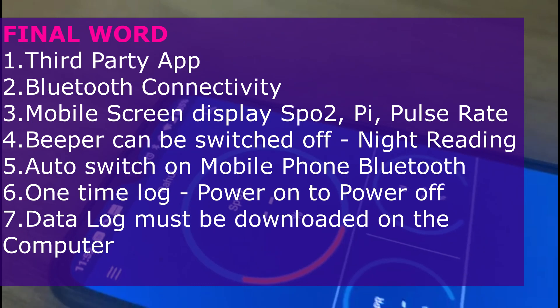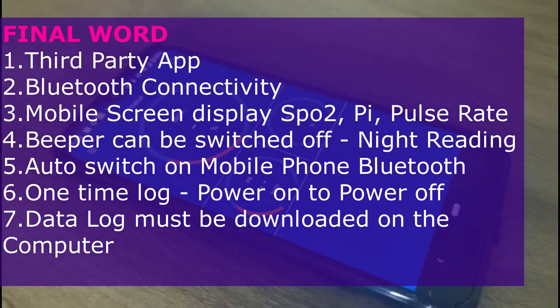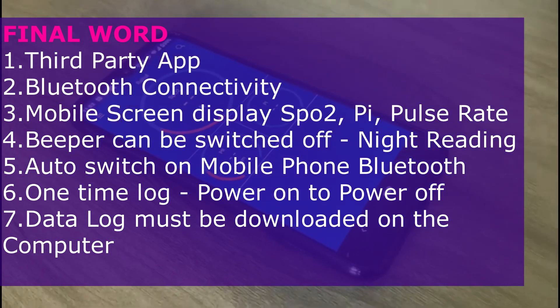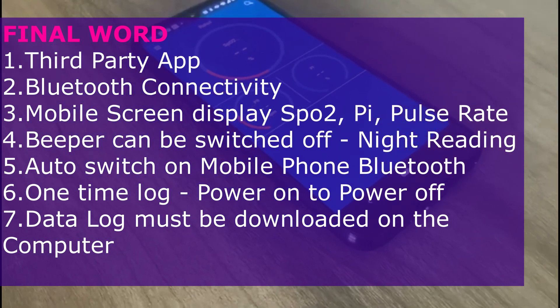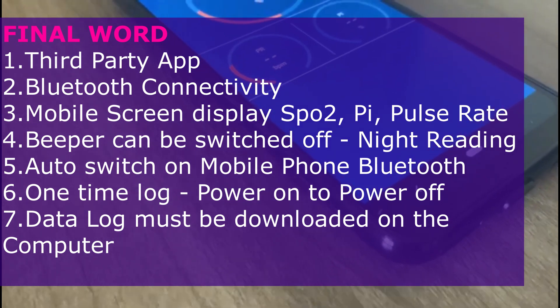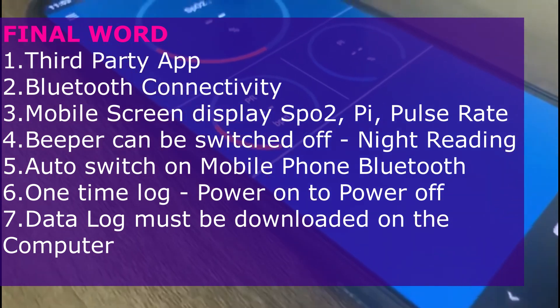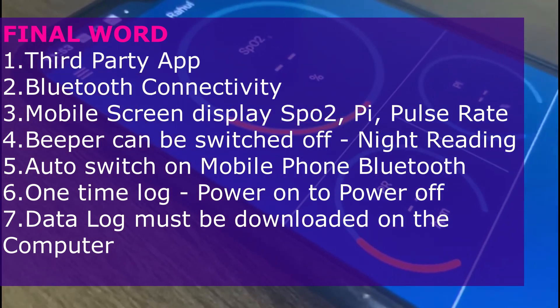Final word: it's a third-party app and it connects beautifully on the Android platform. The screen provides a larger display for SPO2, perfusion index, and pulse rate. The beeper can be switched on and off for night readings. If your phone's Bluetooth is switched off, once you switch on the app it automatically switches on the Bluetooth, searches for your oximeter, and gets paired. This is a great feature, especially keeping in mind that the oximeter will be used by elders, for whom Bluetooth pairing is not always easy.